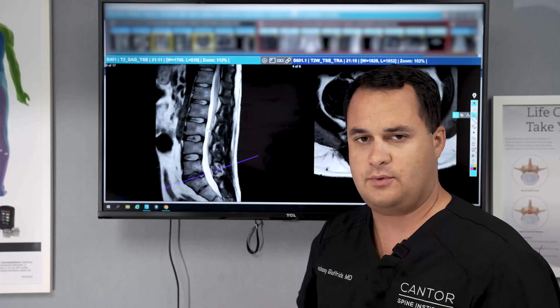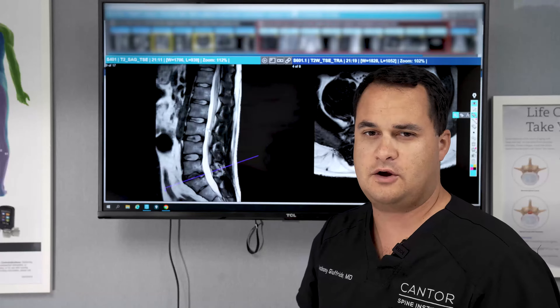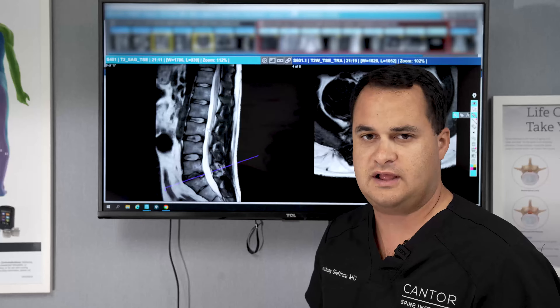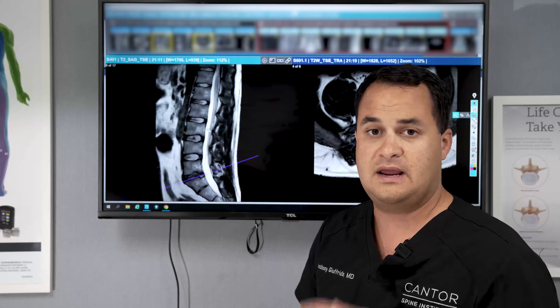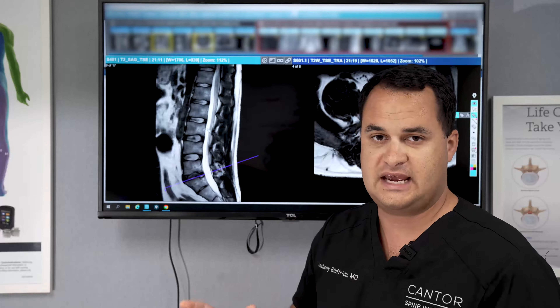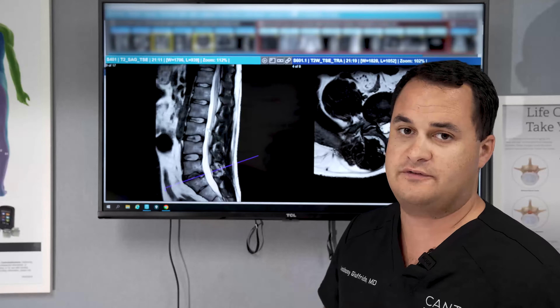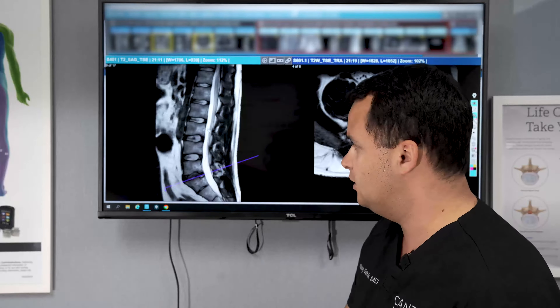All right guys, I want to do a quick MRI review. We have this 38-year-old male with severe radiculopathy on the right side, better known in the population as sciatic pain. So we're going to look at their MRI and try to figure out what's going on.